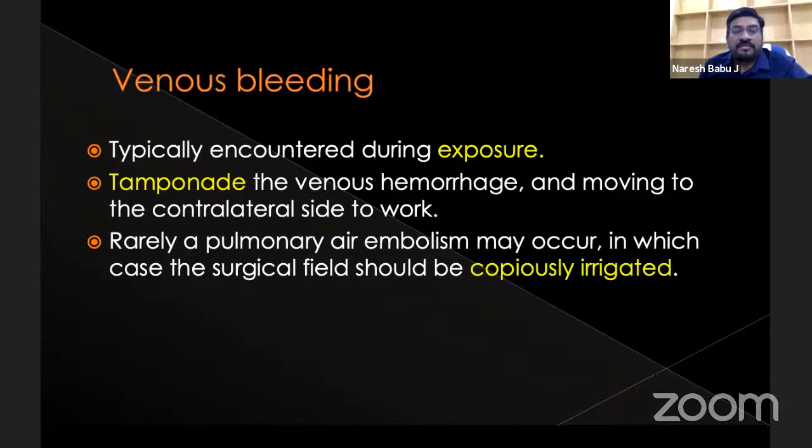Venous bleeding is typically encountered during exposure at C1-C2. Tamponade is the best treatment. We should use large pieces of patties or Surgicel to control this bleeding. When you encounter air embolism, it has been suggested to copiously irrigate the surgical field to dilute the effect of the embolism.